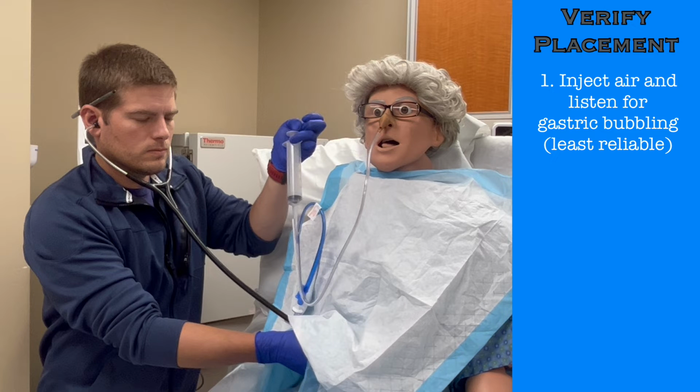And that could mean you need more tube, or it could mean you ended up in the lungs instead of the stomach. We often use this method of verification to give us a good idea that we reached the stomach, but often we rely on more definitive methods before providing treatment through the device.